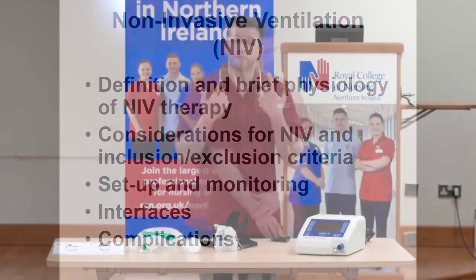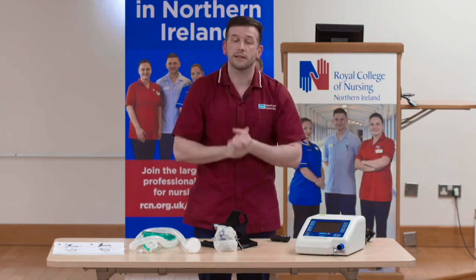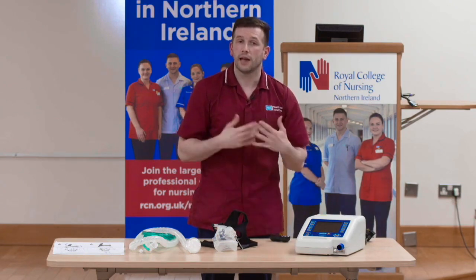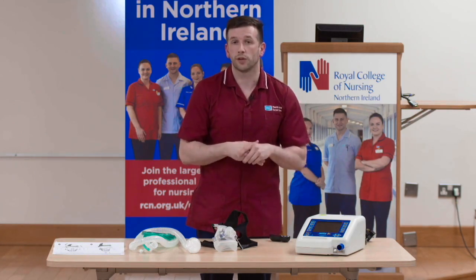It's the use of a face mask that covers the structures of the mouth and nose, a tight-fitting mask that connects to an air pump. The air pump delivers positive pressure to improve ventilation for your patient.